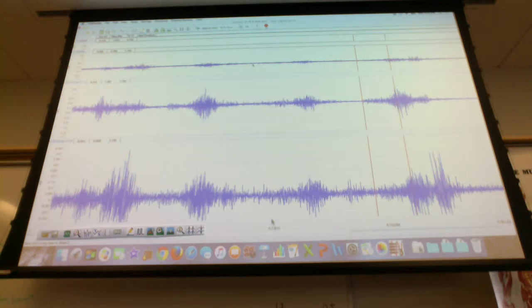Is extension going to be the bottom sections or still? It's not going to be, it's the bottom and top are telling you what muscles are involved, right? The extension is when the point at which you're putting your arm downwards. So it's going to be some point after, yeah. So this is flexion, that's extension, yeah.